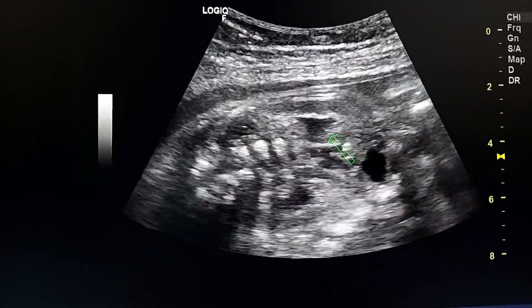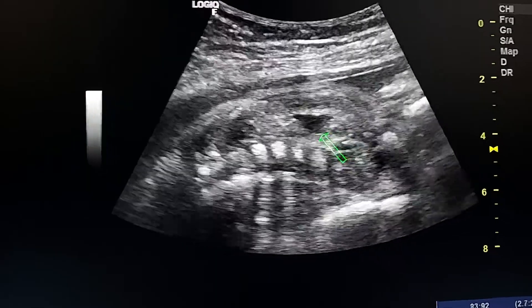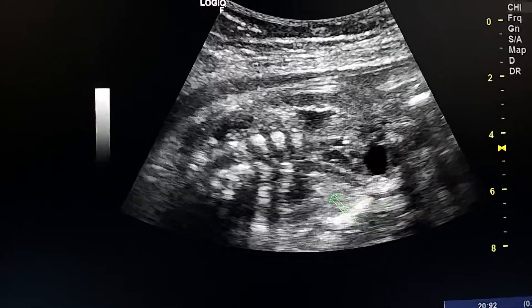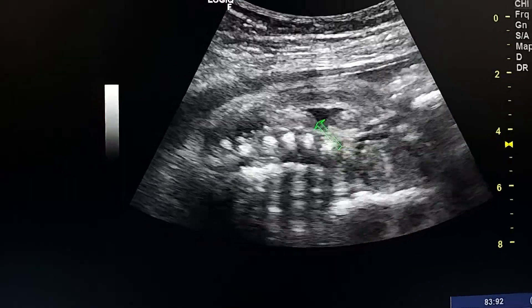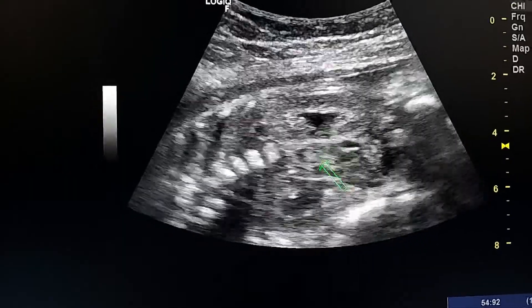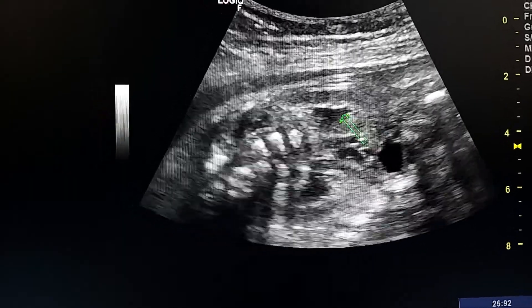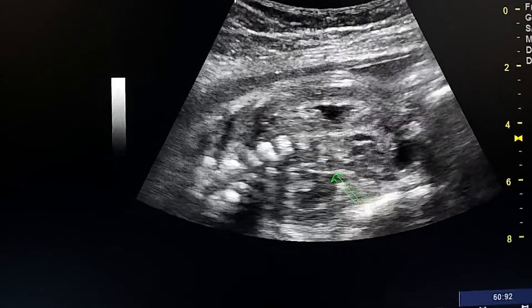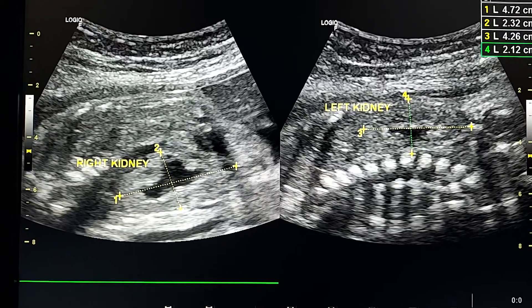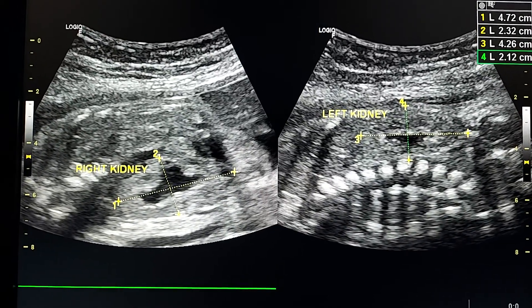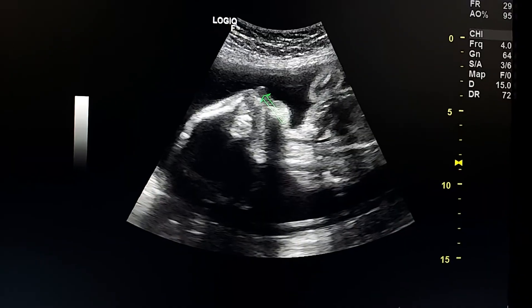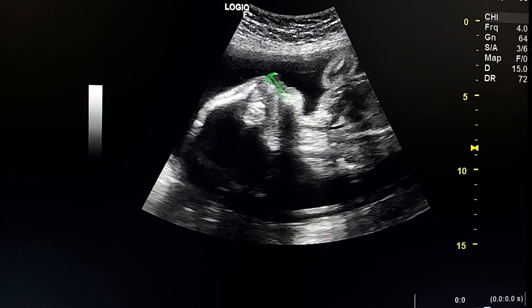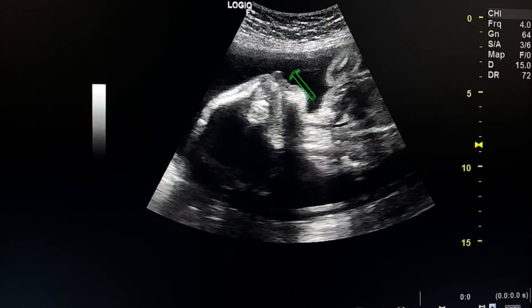Here in this coronal view of the abdomen we see bilateral hydronephrosis. This is one kidney and this is the other — both kidneys are dilated. Another anomaly present is cleft palate and cleft lip.